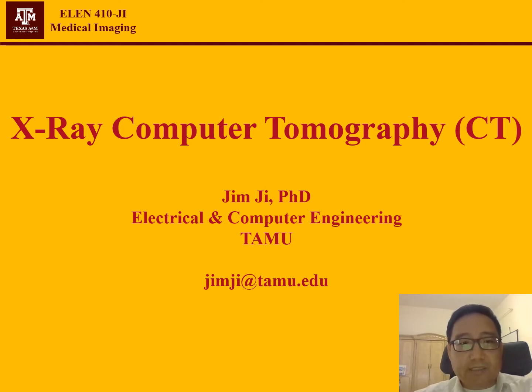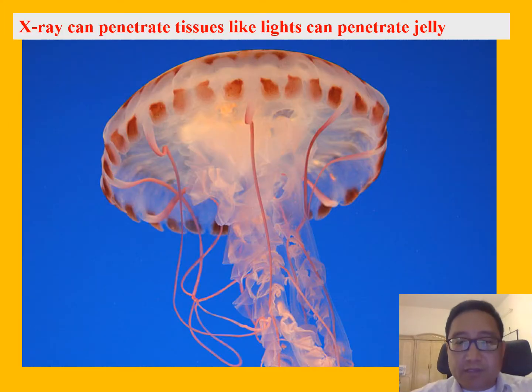Today, I'd like to talk about X-ray computer tomography, or CT. You probably heard about CT, but what CT is based on is typically X-ray. Now, X-ray is very interesting because it can see through the human tissues just like the visible light can penetrate a jellyfish.